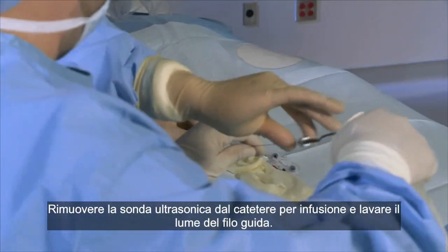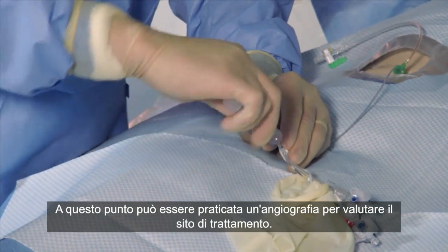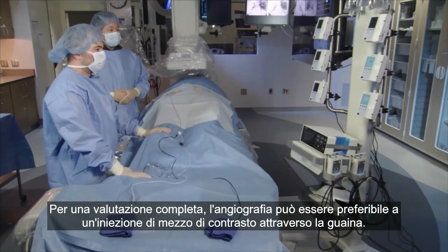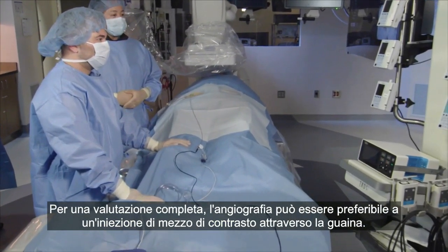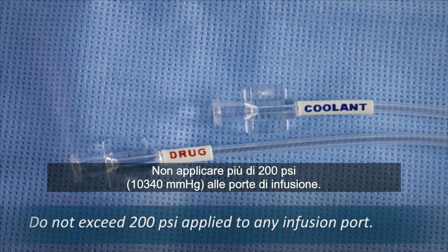Remove the ultrasonic core from the infusion catheter and flush the guide wire lumen. Angiography may be performed at this time to assess the treatment site. For full assessment, angiography may be preferable to a contrast injection through the sheath. Do not connect the infusion catheter drug or coolant infusion ports to a power injector. Do not exceed 200 psi applied to any infusion port.